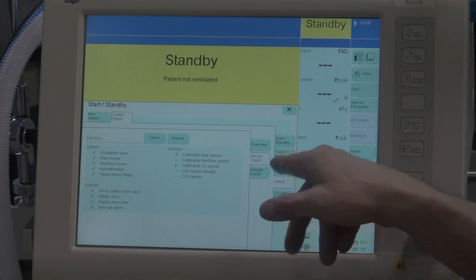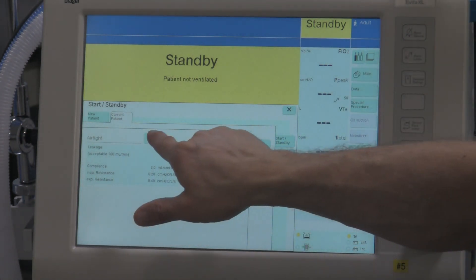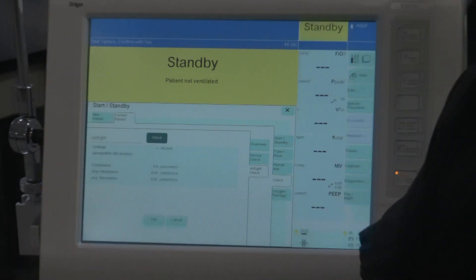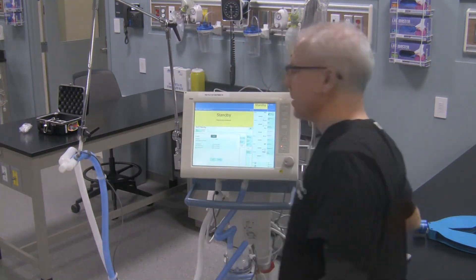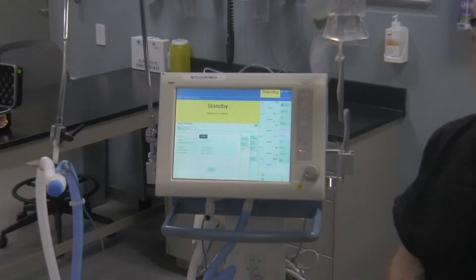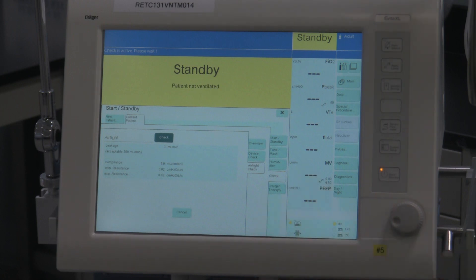Before we move on, we want to do the next device check and that's the airtight check. So we're going to hit the tab that says 'Airtight check,' then follow the directions displayed. To get the check running, simply hit the word 'Check.' Now it says 'Seal the Y piece, confirm with Yes.' So this is where you need the circuit plug. I'm going to take the test lung off the ventilator, place the circuit back on the holder, take this cap, and cap the circuit right over there. Then confirm with Yes. It says 'Check is active, please wait.'